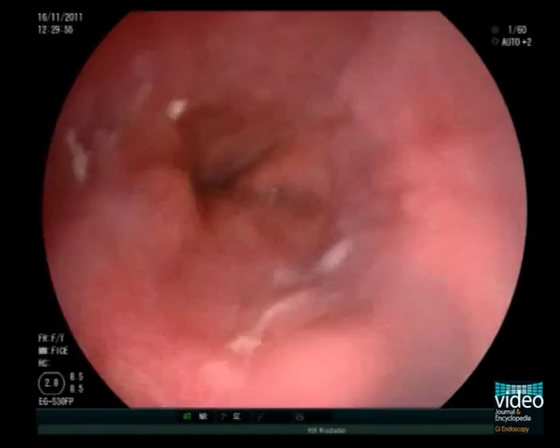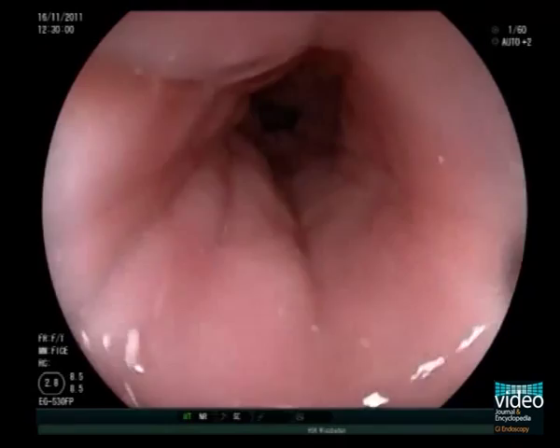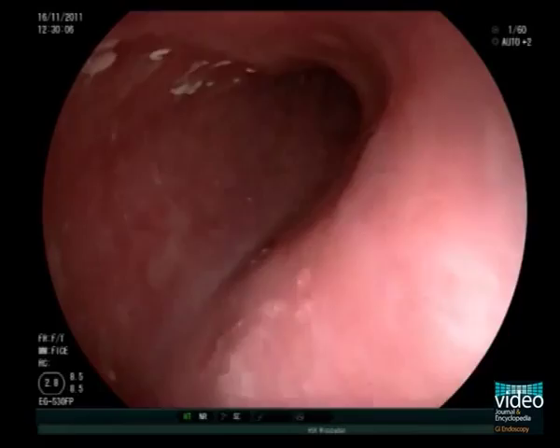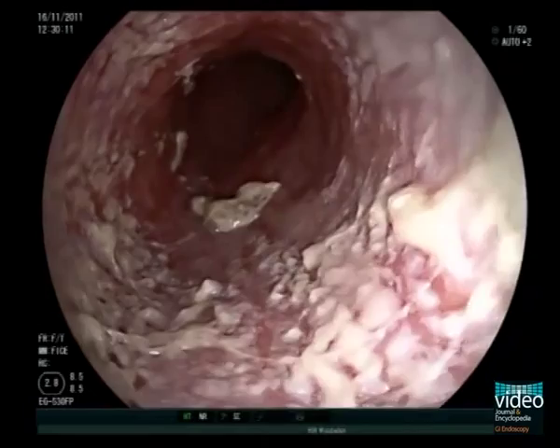The mucosa of the distal esophagus appears normal. However, when pulling back the endoscope, white and yellowish plaque-like lesions are seen.